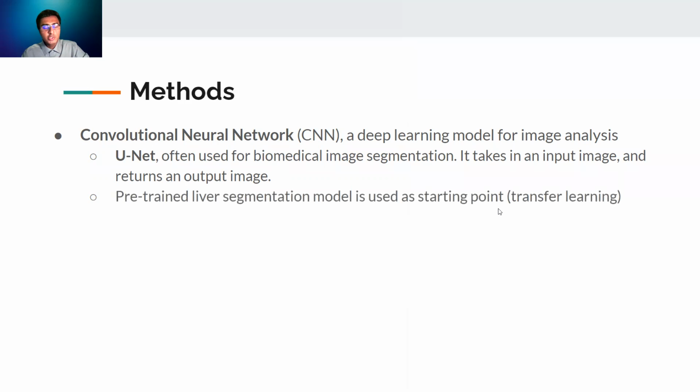Moreover, a pre-trained liver segmentation model was used as the starting point of our UNet. This process is called transfer learning, as we are able to transfer the knowledge from an existing to a new algorithm rather than having to learn completely from scratch.